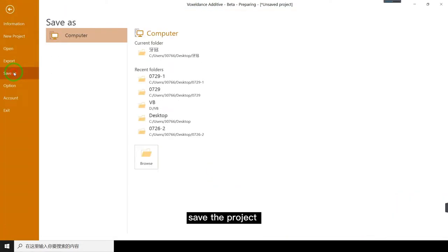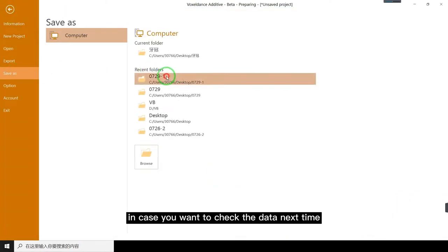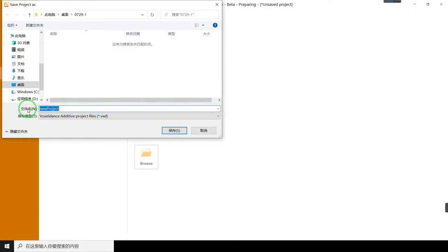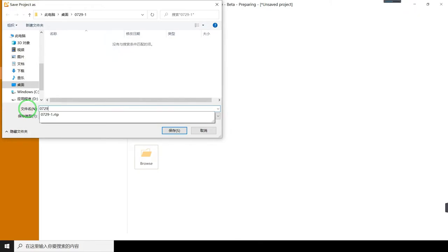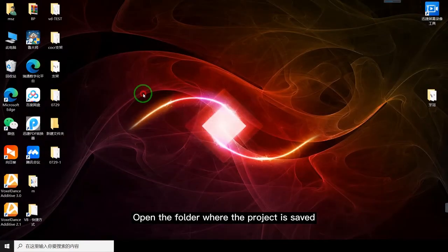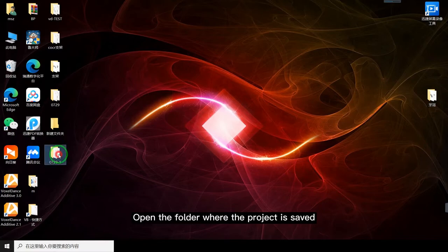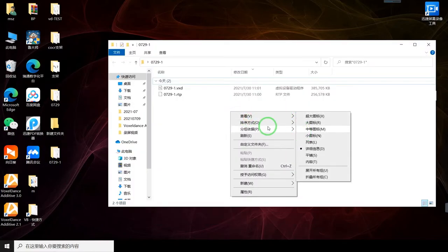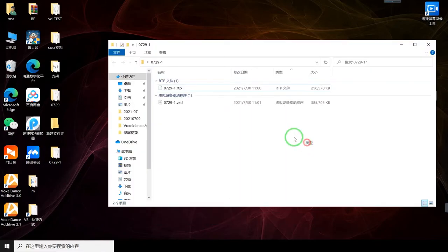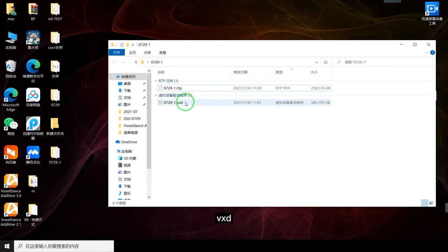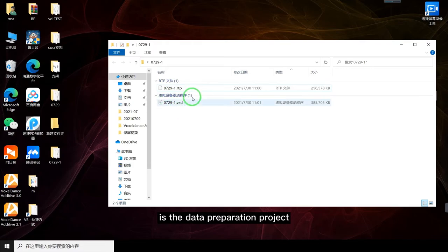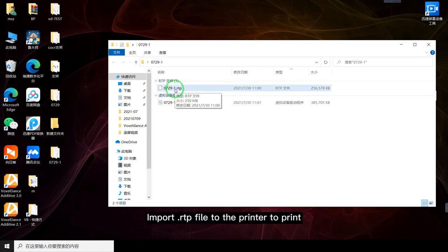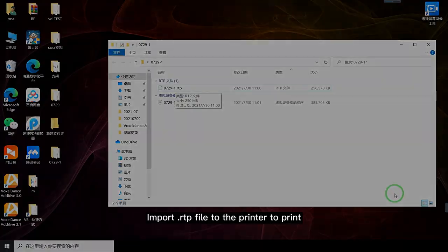Save the project in case you want to check the data next time. Open the folder where the project is saved. File with the suffix .rtp is the printing file. .vxd is the data preparation project. Import .rtp file to the printer to print.